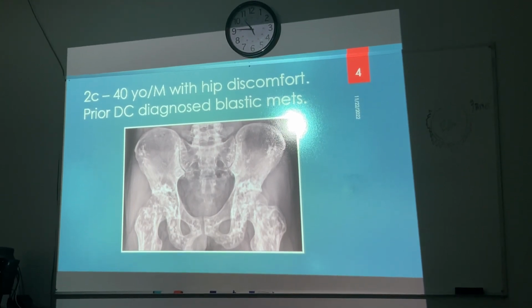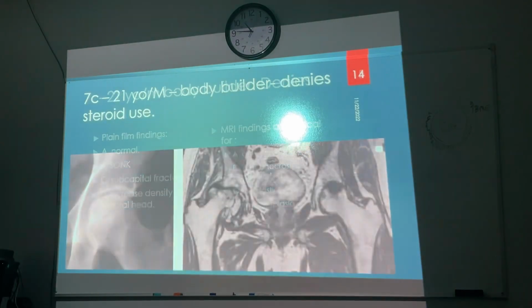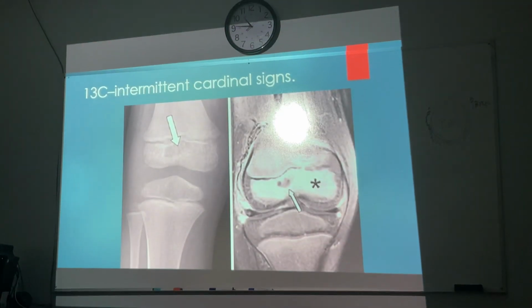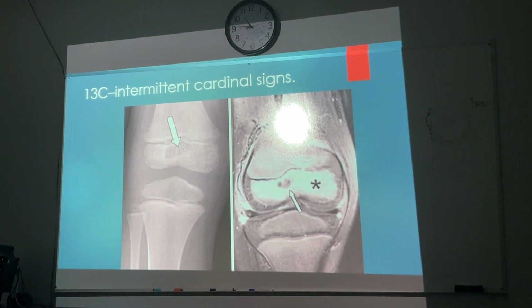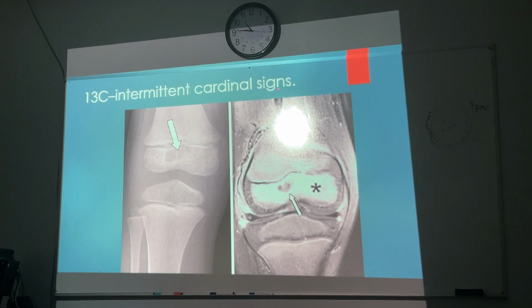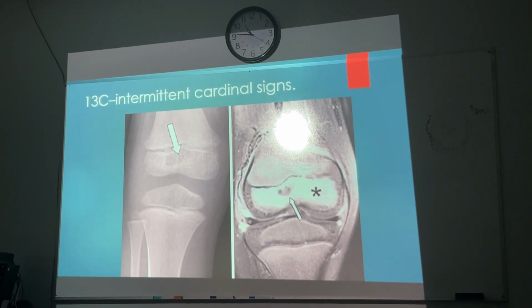If it's just the epiphysis without the cardinal signs, without the clinical, it's chondroblastoma. It's in the epiphysis, okay, but it's got bone marrow edema. Chondroblastoma wouldn't have that much bone marrow edema, okay, but with the cardinal signs it's osteomyelitis. No cardinal signs, and then it becomes possible chondroblastoma.